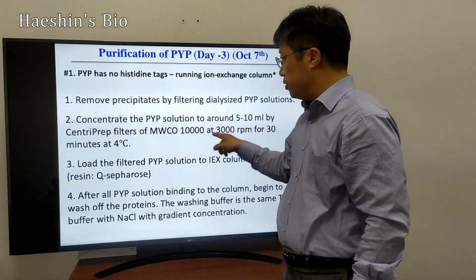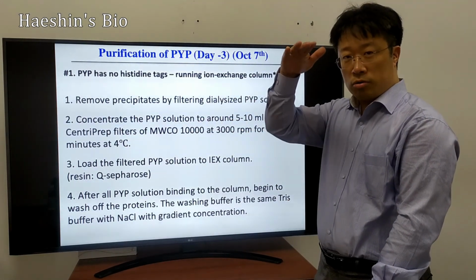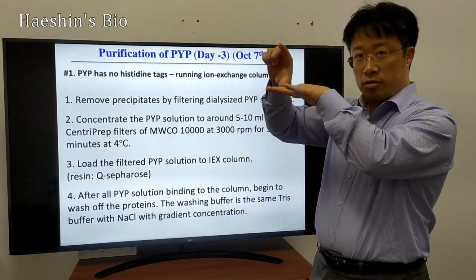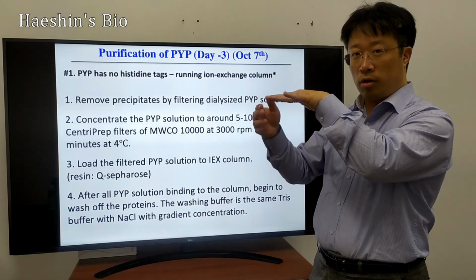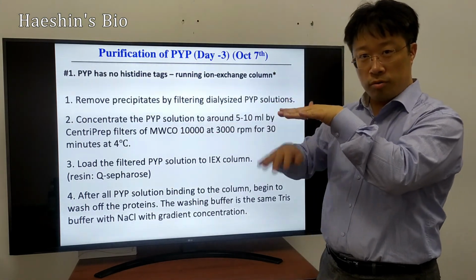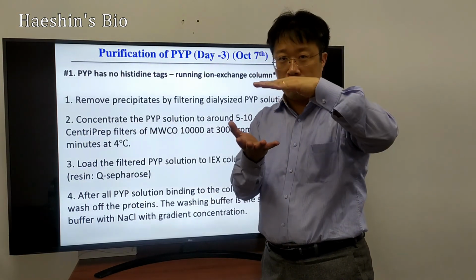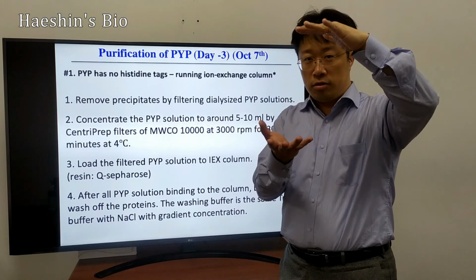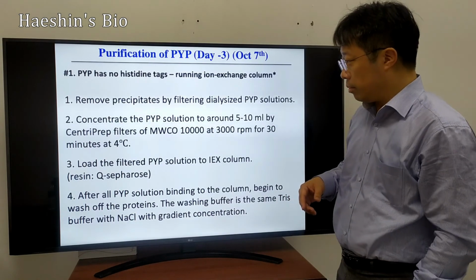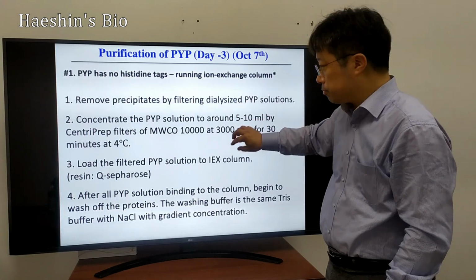So you centrifuge it. You centrifuge at about 3,000 RPM. And then water also, of course, comes through. If this is the membrane, water goes down, and then they concentrate the overall solution. Also, molecules smaller than the cutoff size will go down too. But the overall purpose is concentration, so that you decrease the volume from about 45 milliliters down to 5 to 10 milliliters to handle properly. So after this, you end up with a solution with this small volume.